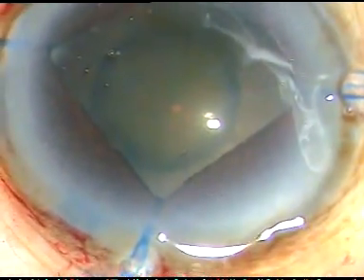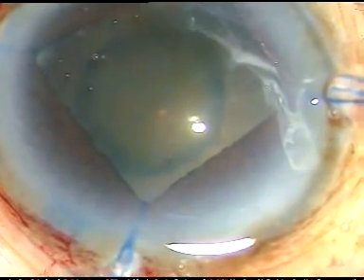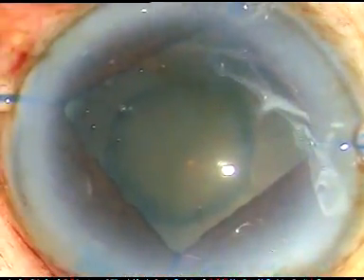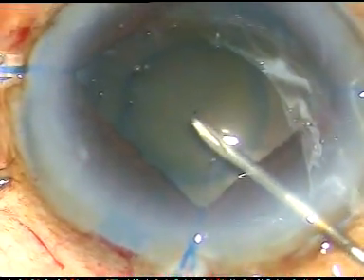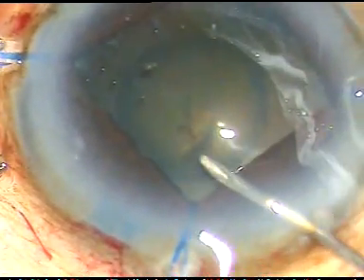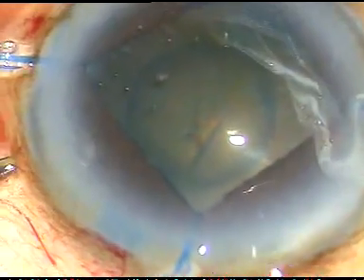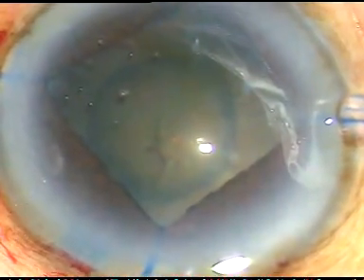Now I am going to do capsulorhexis. See what happens when I puncture the anterior capsule — the whole lens moves and there are wrinkles on the anterior capsule. This indicates that the zonule is very weak.